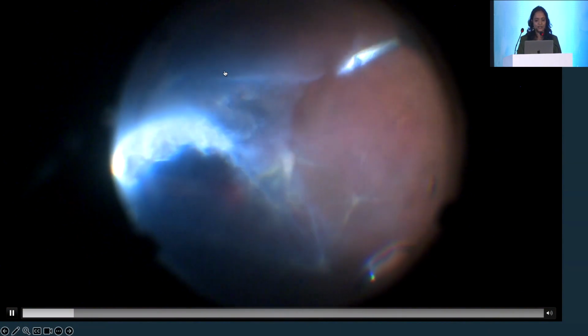Now you can see that there is a lot of vitreous haze, opacities which we took care of, and then there was this nasal incarceration of the retina. Here you can see that there are retinal folds nasally, and this one here. So I released it from its incarceration, did a thorough base shaving, went in, saw there were chronic folds at the macula, and I managed to attach this retina.